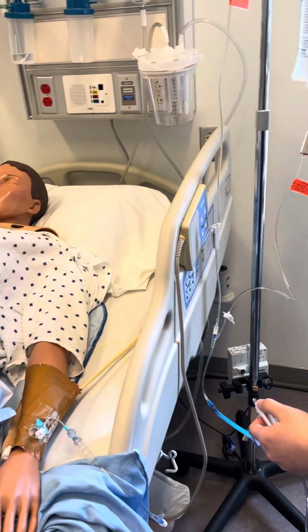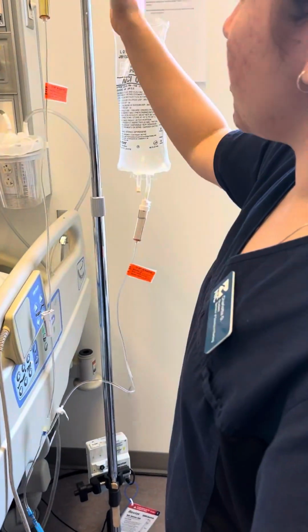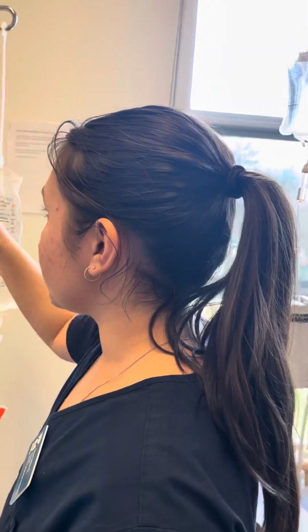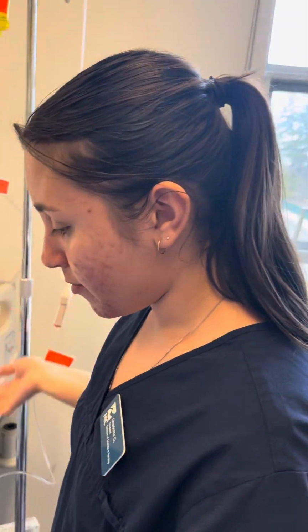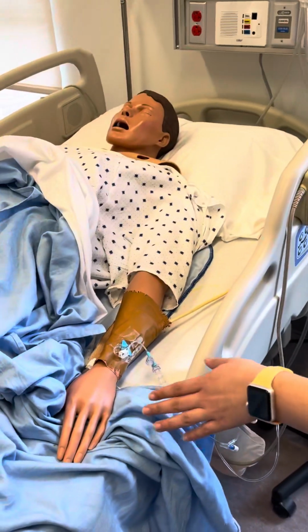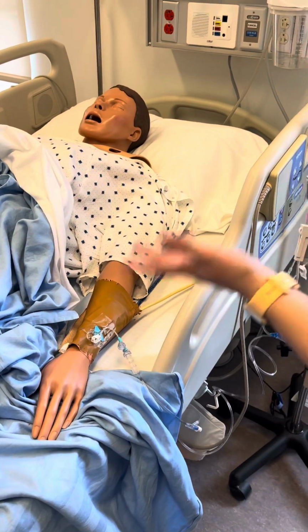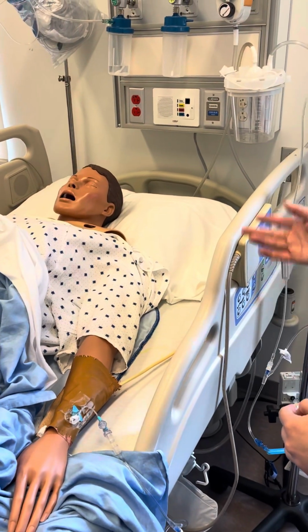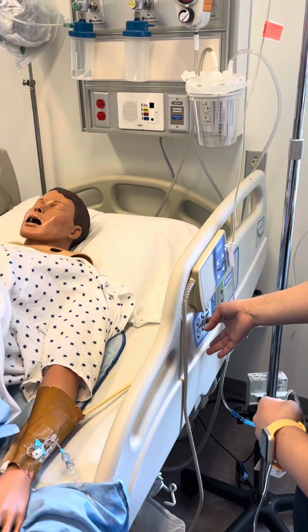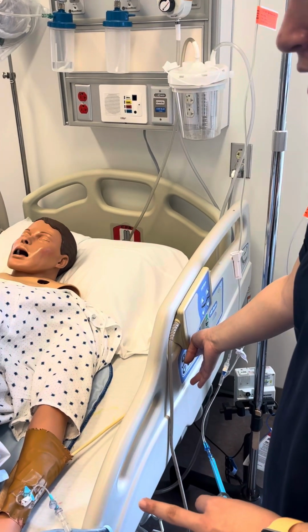So we would figure out 100 drops per minute, all the lines are open. This medication is running, and like I said, 100 drops per minute over 20 minutes. And then once that's done, the bag will keep going. I'll come back in 20 minutes to check on it. I'll check the IV site again, make sure the medication's running through okay. And then double check with the patient that they understand what's going on. Lower the bed. Put all my tubing away so it's not in the way. Make sure my patient is comfortable, document appropriately.